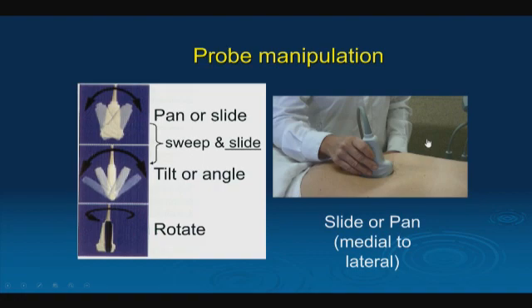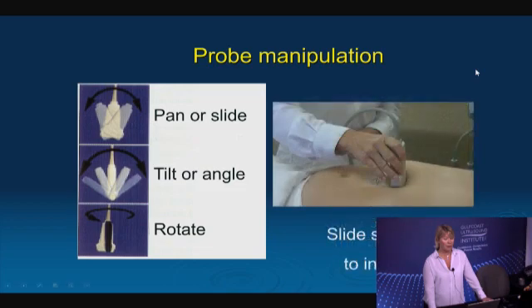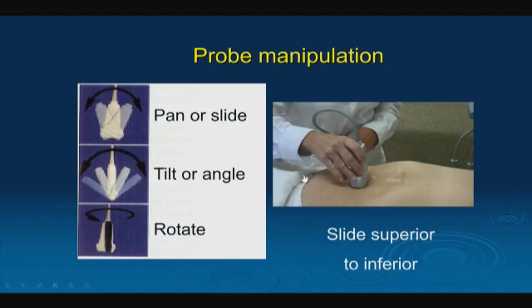So typically when we're doing some type of abdominal scanning or fast exam, you're making bigger movements. But when you're doing vascular access or cardiac, they're very, very minute movements, barely even noticeable to the field. So you have to just understand that different areas that you scan, there's different approaches. Now, if I was in transverse, notice I'm keeping the transducer perpendicular and I'm sliding inferior and then superior.